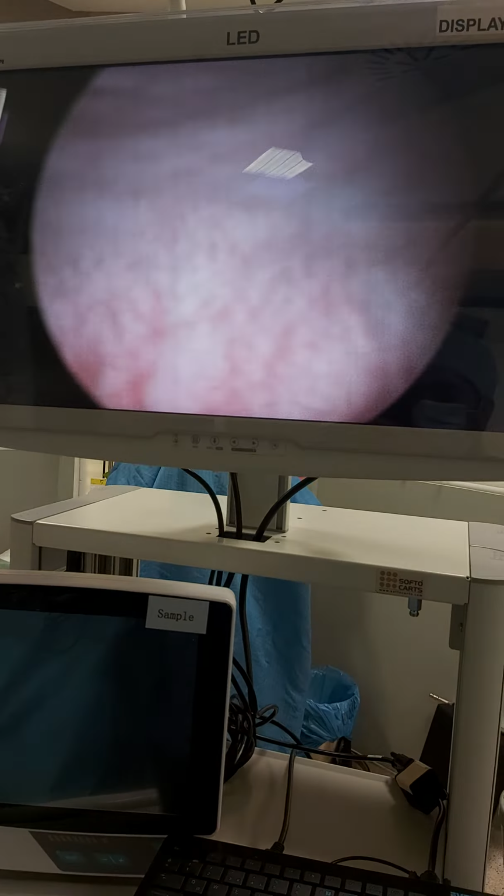When I look at the rest of the mucosa, the rest of the bladder, maybe she has some difficulty in urination. There are some muscle bundles prominent here, hypertrophied, and the rest. So for sure, it's very obvious she has no interstitial cystitis because the bladder capacity is normal.